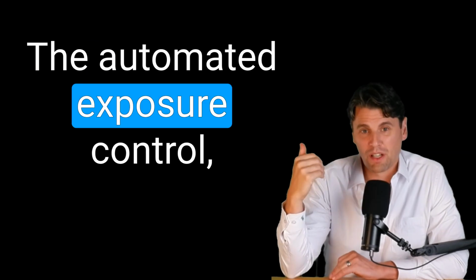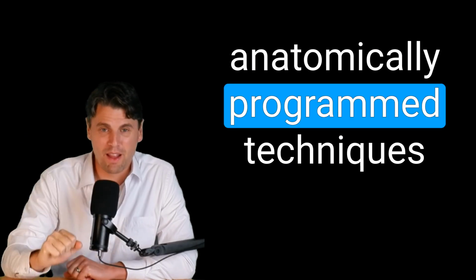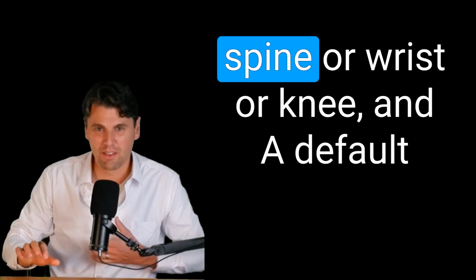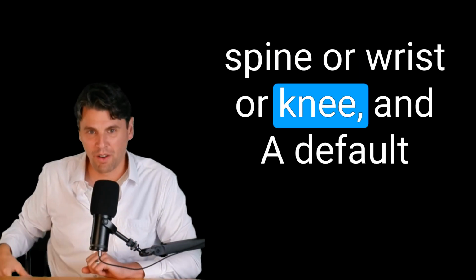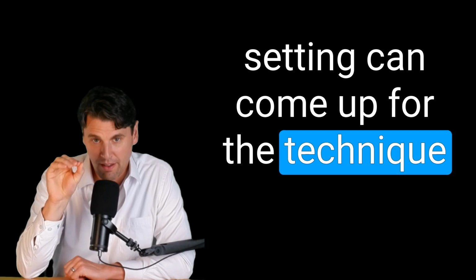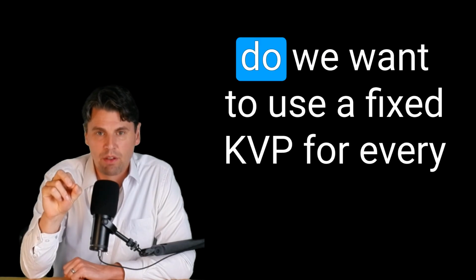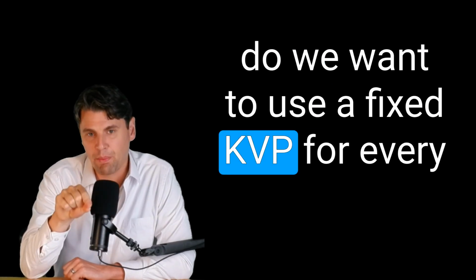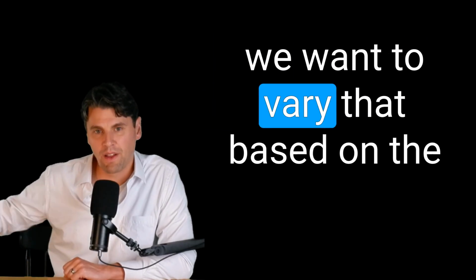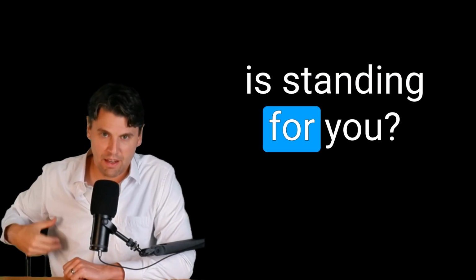With the automated exposure control, it is possible, using what's called anatomically programmed techniques, to essentially select on the UI spine or wrist or knee, and a default setting can come up for the technique parameters, including the KVP. And what we're talking about now is, do we want to use a fixed KVP for every knee exam, for every abdomen exam, or do we want to vary that based on the actual patient, which is on the table or which is standing for you?